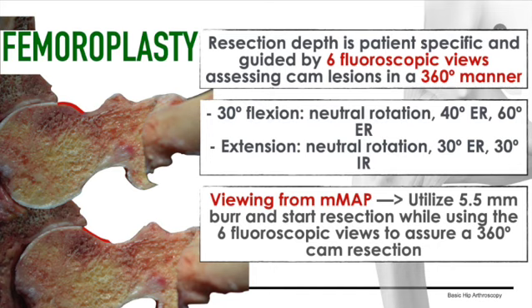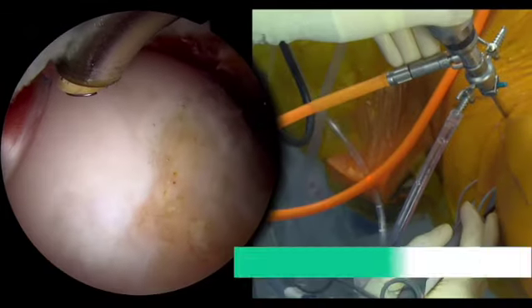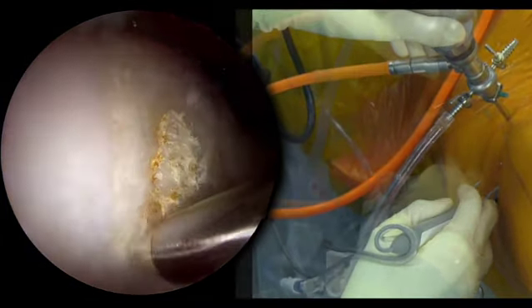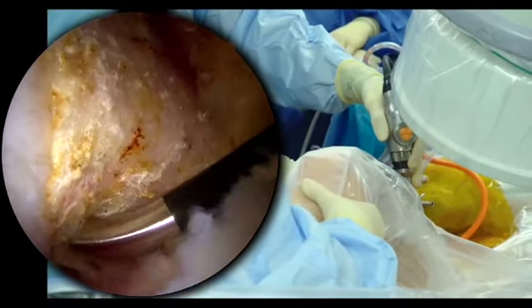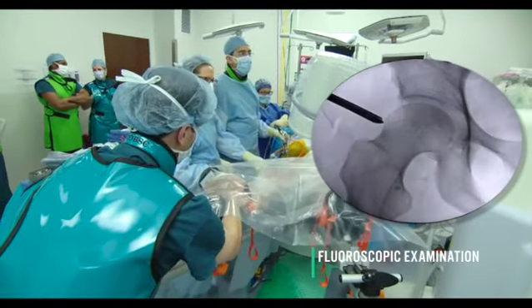Femoral cam resection is performed while assessing the cam in a 360-degree manner by fluoroscopically positioning the hip into 6 different positions. A 50-degree radiofrequency probe is utilized to mark the most proximal aspect of the resection at the femoral head-neck junction. The periosteum will be cleaned to allow for the burr to have a clean and optimal resection. The cam is assessed at this point in the previously referred 6 positions.